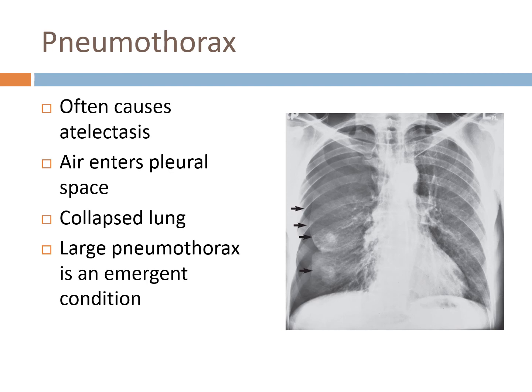So if you have a large pneumothorax, for example, where the whole lung is collapsed, it is considered emergent, and you want to get a chest tube in as soon as possible. You can kind of see here by your little arrows on the right side, you can see that lung border there and how you have more air on the outside part.